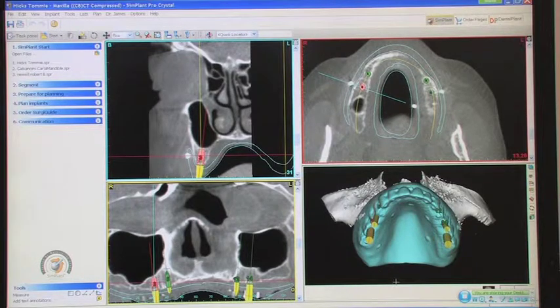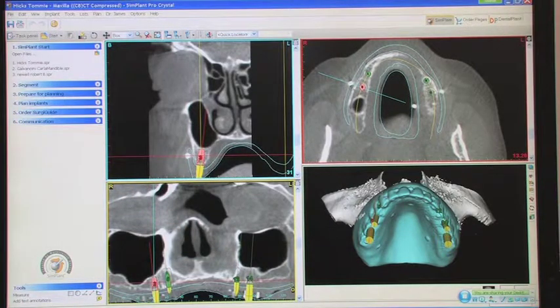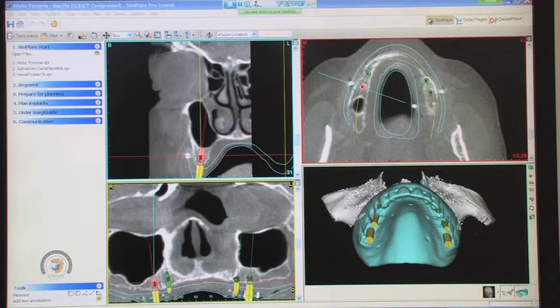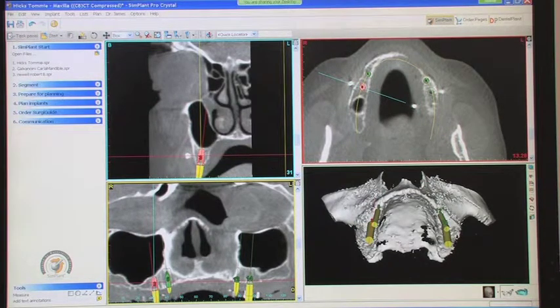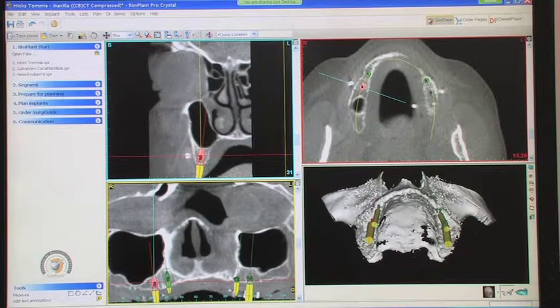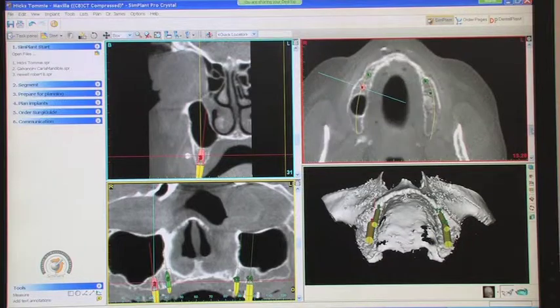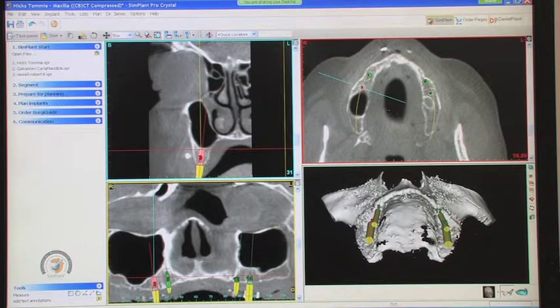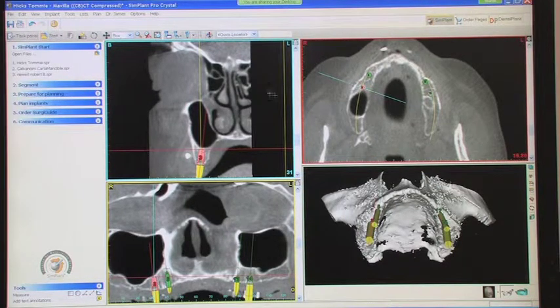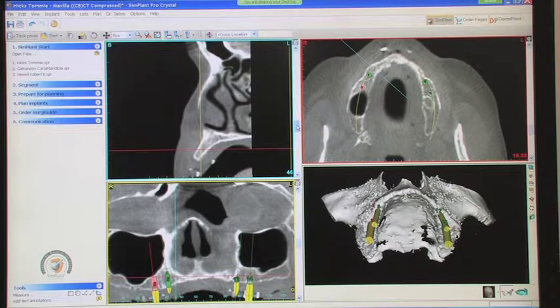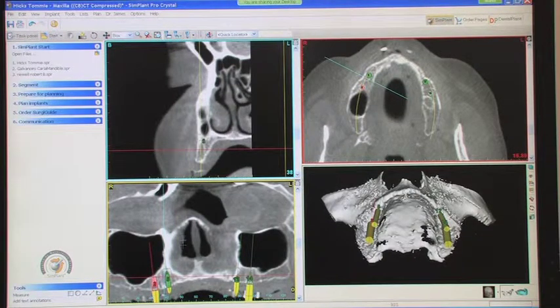To review the different views we have here for our audience: on the lower right we have a 3D rendering of the patient, so you can see the patient's prosthesis. We can take that away and you can see the patient's ridge. Above we have axial slices we can scroll through. There's a yellow curve along the arch, a blue cross-section line, and on the lower left is a panoramic-type view.